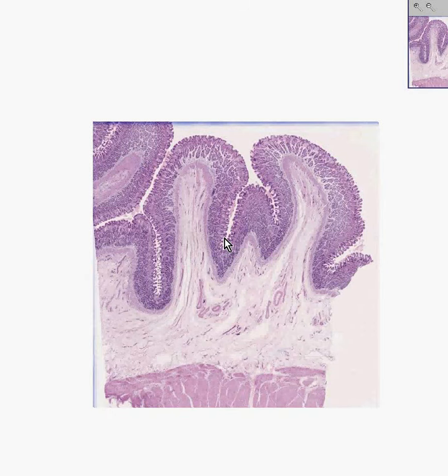Look at this really, really beautiful slice of stomach. You could see a really nice mucosa, which is this whole blue area along here. You can see a beautifully defined rim of muscularis mucosa, which is this little pink band along here. You can see the looser connective tissue of the submucosa. And last but not least, you can see various smooth muscle bundles.